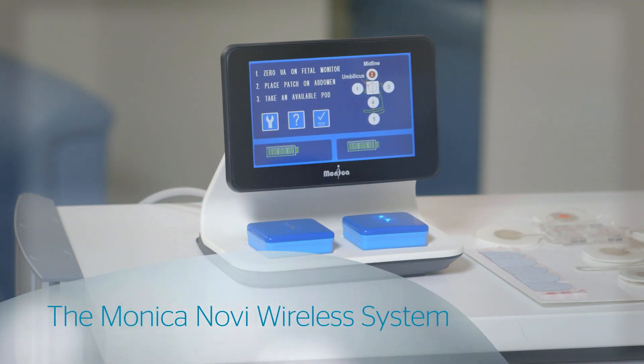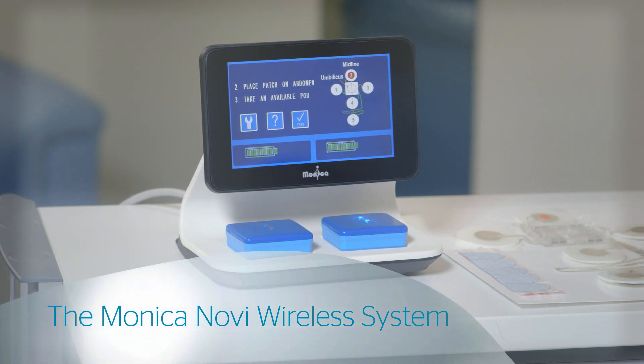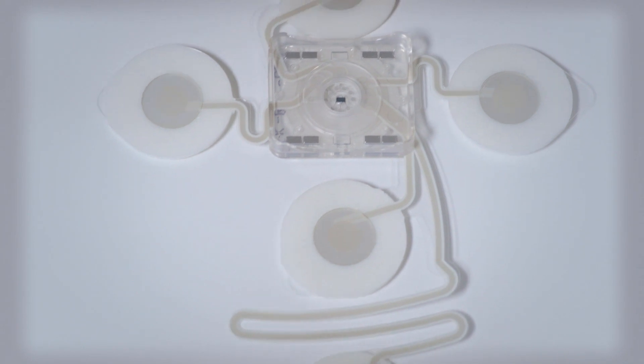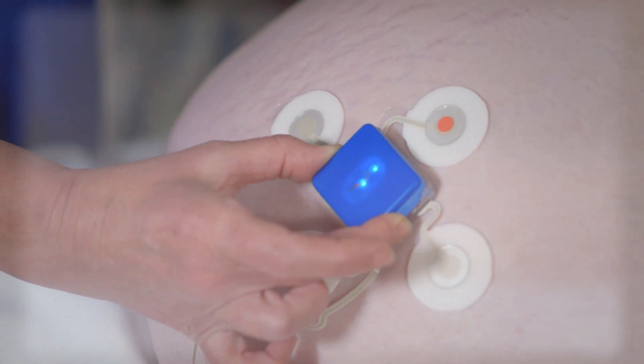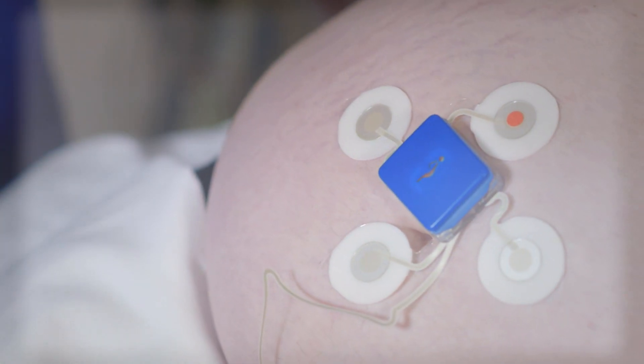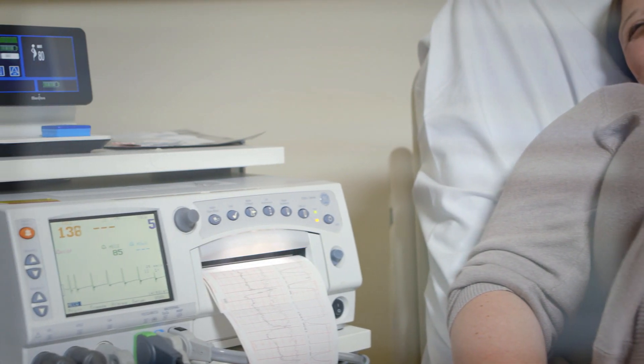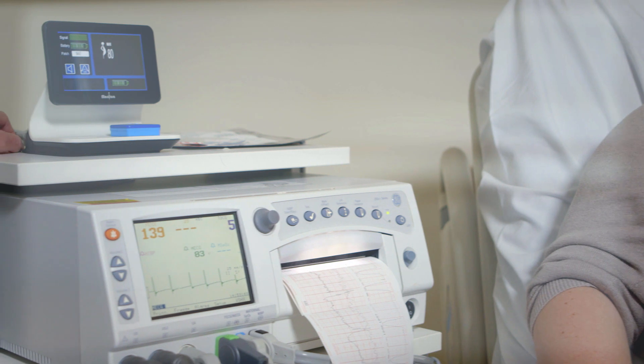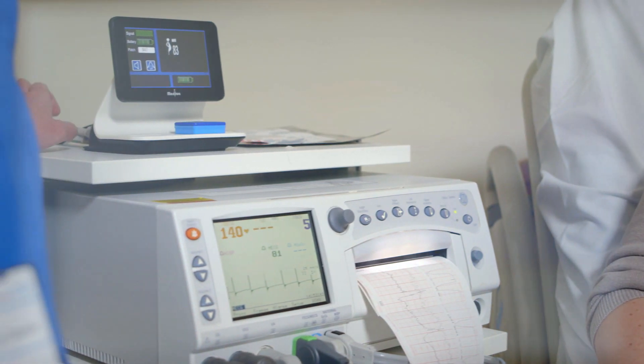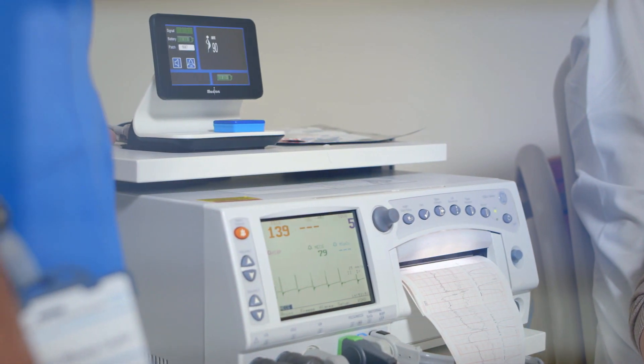Novi consists of three elements: a single-use peel-and-stick electrode patch to detect the electrical signals on the abdomen; a small, reusable pod that magnetically clips to the patch and wirelessly transmits the key monitoring data to the Novi interface; and the Novi interface, that connects directly to your monitor's front panel transducer connectors.